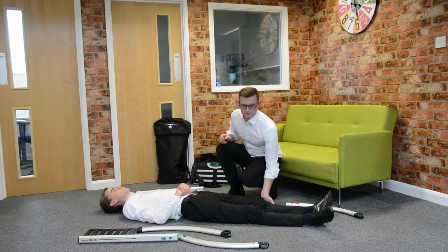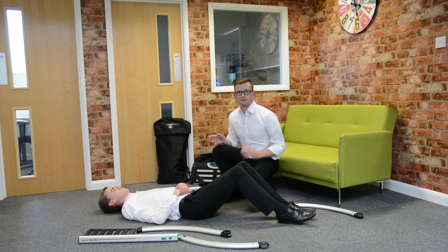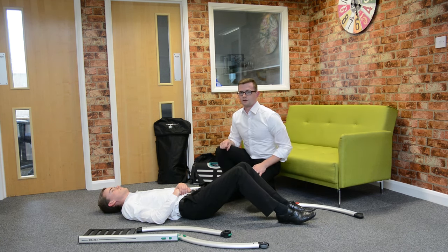Then make sure the fallen person can lift their legs, like this, so he can fit the base unit, the seat unit of the Raizer chair.